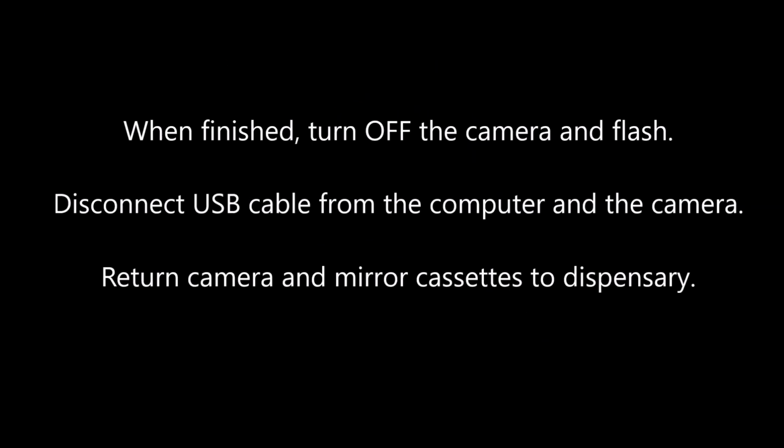When finished, turn off the camera and flash. Disconnect USB cable from the computer and the camera. Return camera and mirror cassettes to dispensary.